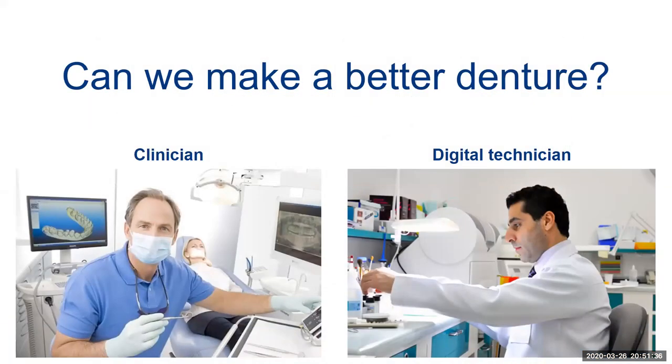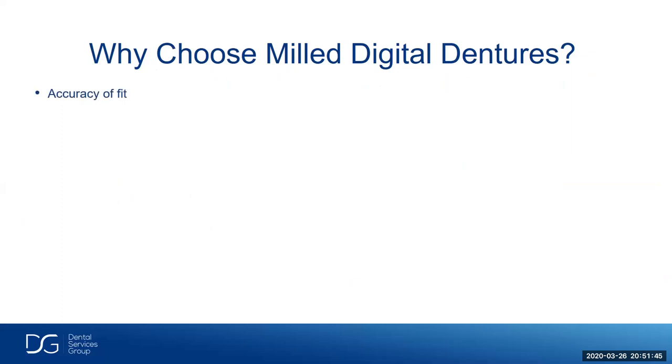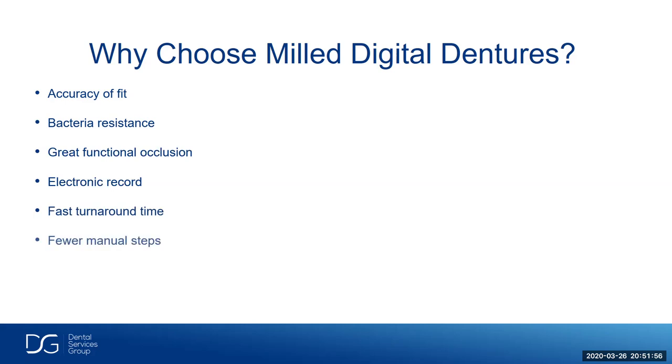Can we make a better denture? I believe we can, between the communication with the clinician, the denture technician, and the digital technician. Now, why choose the milled denture over analog dentures? The accuracy of fit, bacteria resistance, the same thing with the printed, great functional occlusion, electronic record, fast turnaround time, fewer manual steps, and consistent quality.